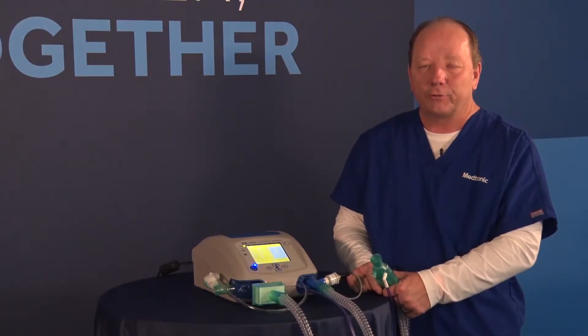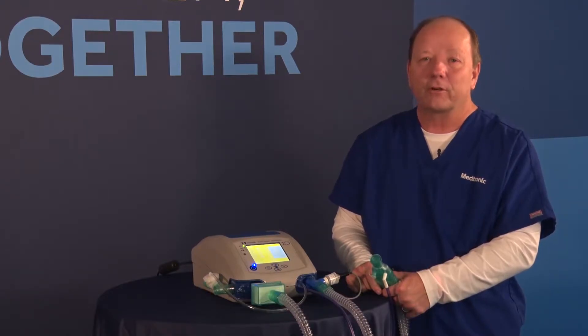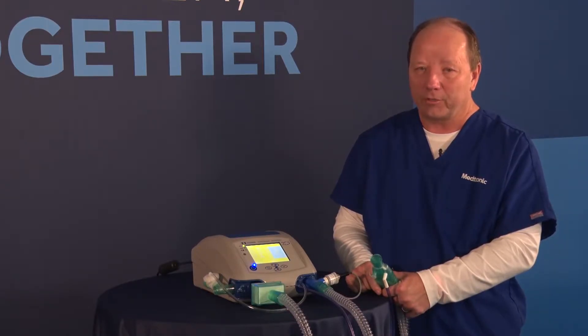Now that we've turned the unit back on to the normal operating mode, we need to go in and do our calibrations. I'm going to start with the flow sensor calibration first.